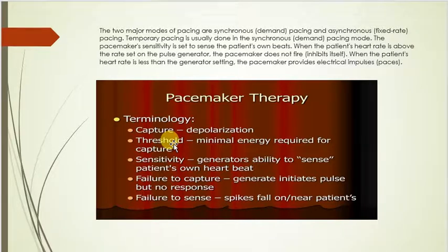So the pacemaker sensitivity is set to sense the patient's own beats. And so when the patient's heart rate is above the set rate on the pulse generator, the pacemaker doesn't fire, it inhibits itself. And so when the patient's heart rate is less than the generator setting, then the pacemaker provides electrical impulses and it paces the patient's heart.